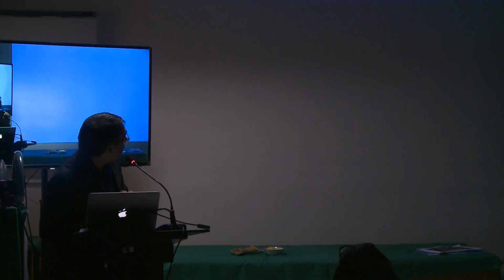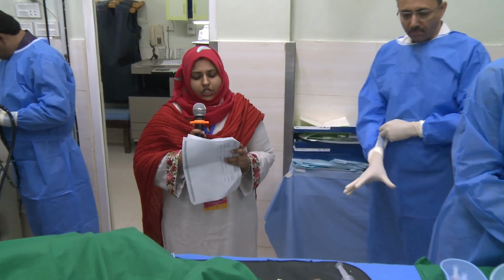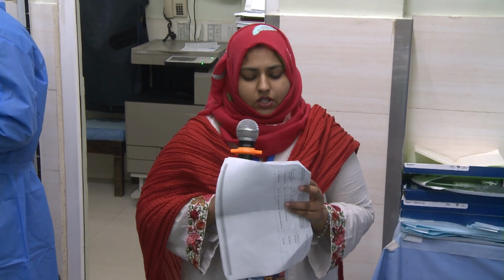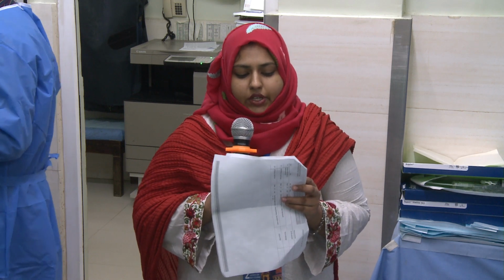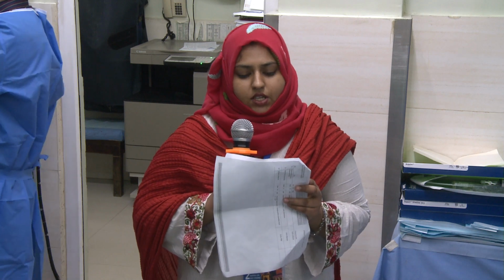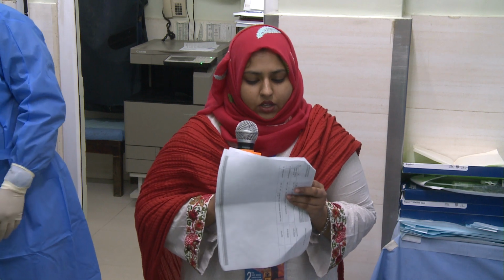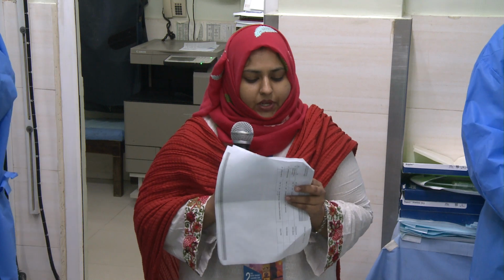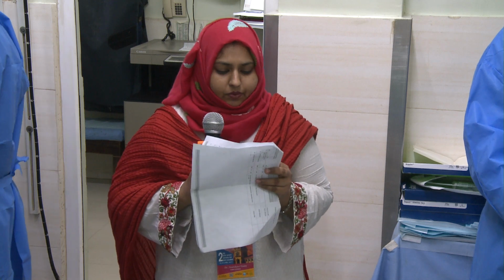Yes, we can. Okay, our next case is of a 55-year-old male who presented with abdominal pain and jaundice for the last 4 months. ERCP and stenting was done in March, and there was suspicion of a periampullary mass on ERCP. CT was done in March, which showed a 2.1 by 2.7 by 1.7 cm mass in the head of the pancreas involving the distal CBD. And there were multiple enlarged lymph nodes in the porta hepatis region, perigastric and para-aortic. The largest one was 1.3 cm. That's it.